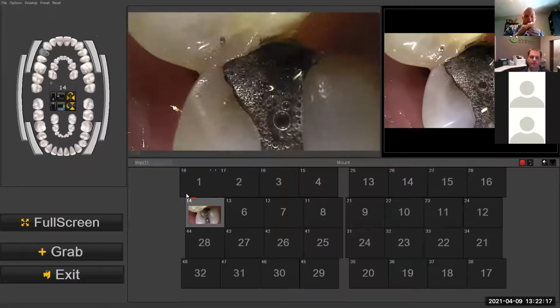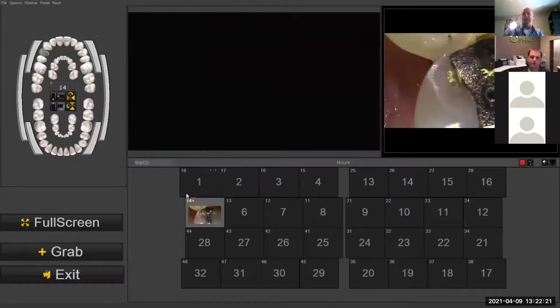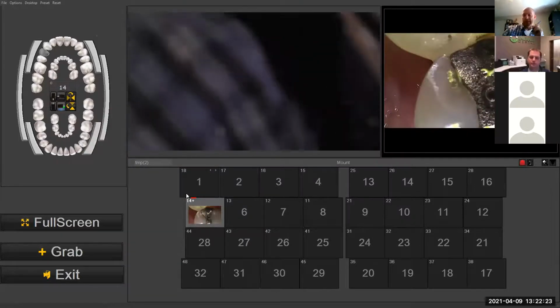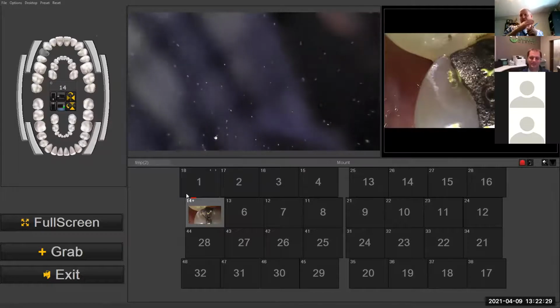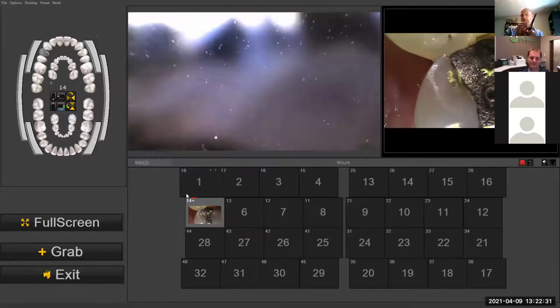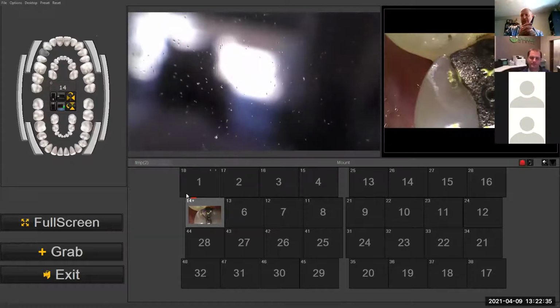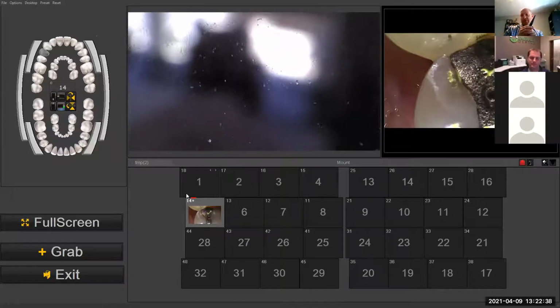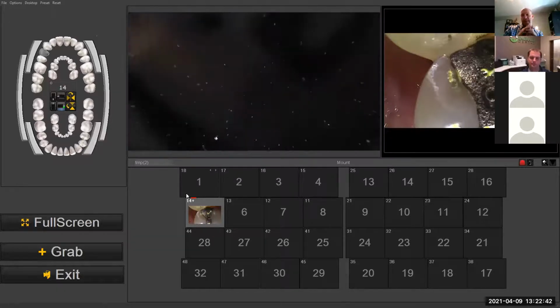Now, you think a foot pedal speeds it up to a degree? Not really. Like most dentists, they have like 18 foot pedals that they hate on the floor, and then the cables and all that. The hand, if it's a well-designed push button type camera, it'll be quicker through this, I think. But again, it's also subjective. It depends on the end user. Some people might like the foot pedal better.